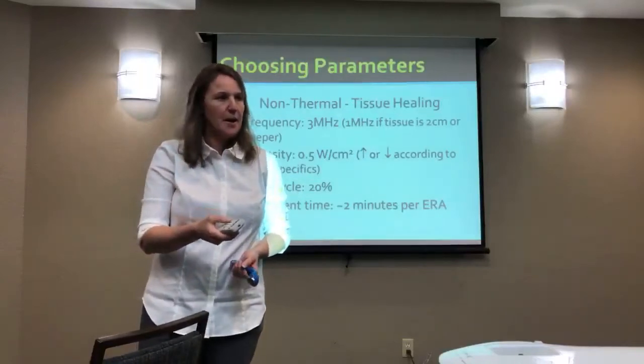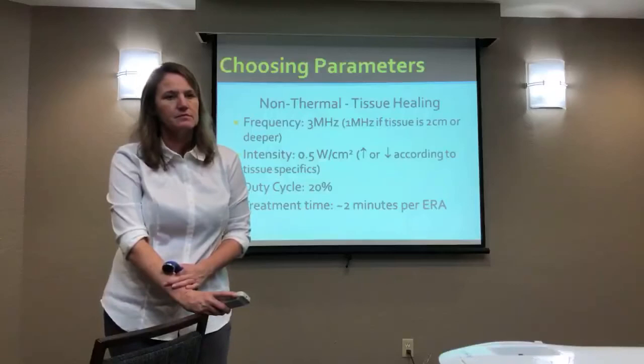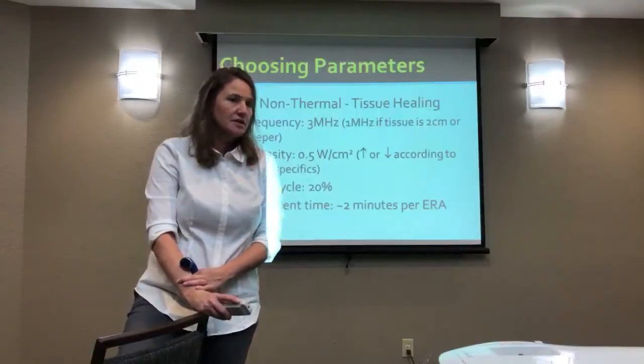Would you apply that if patients have visible varicose veins, but they're never diagnosed that they needed to do something about it? So your target is under the varicose veins, or that is your target? Under. I mean, I wouldn't have a problem with doing ultrasound.